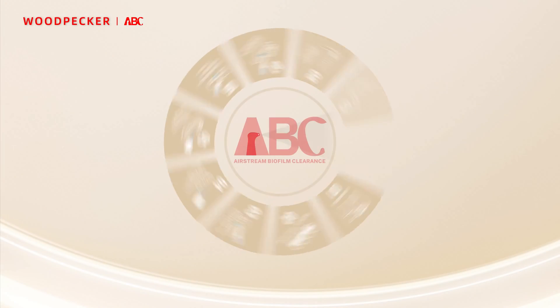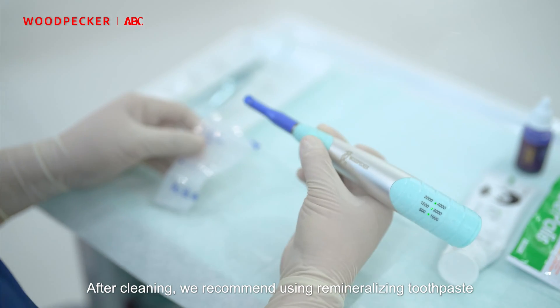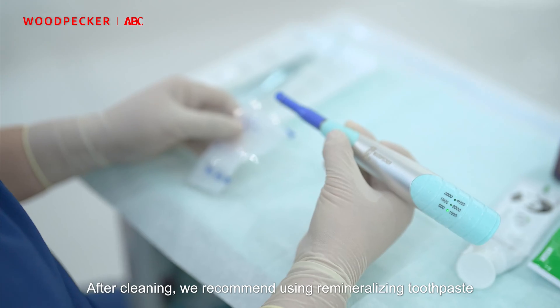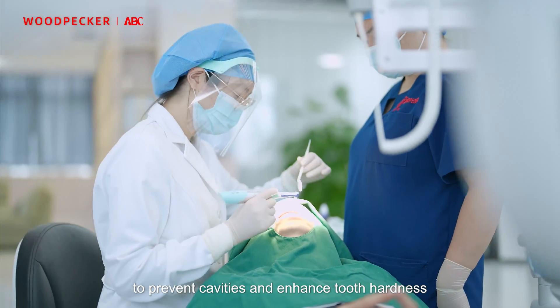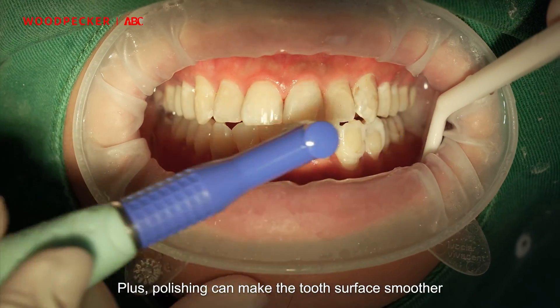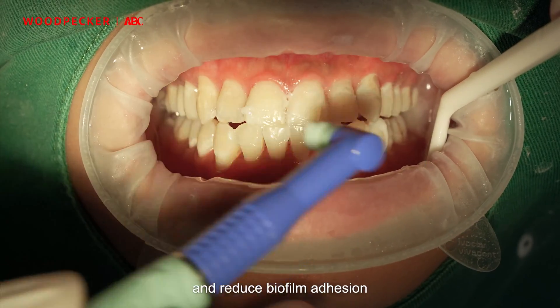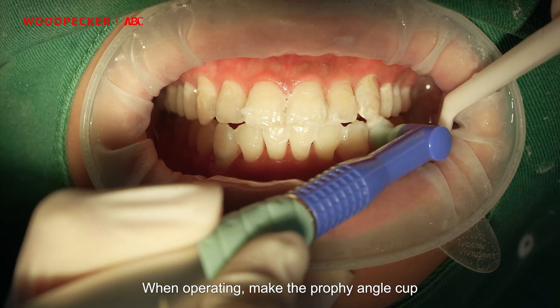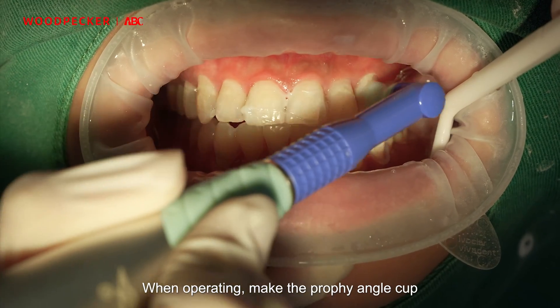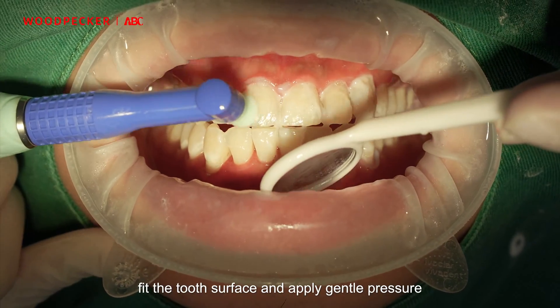Step 8: Dentinal Tubules Sealing. After cleaning, we recommend using remineralizing toothpaste to prevent cavities and enhance tooth hardness. Polishing can make the tooth surface smoother and reduce biofilm adhesion. When operating, make the Profi Angle Cup fit the tooth surface and apply gentle pressure.